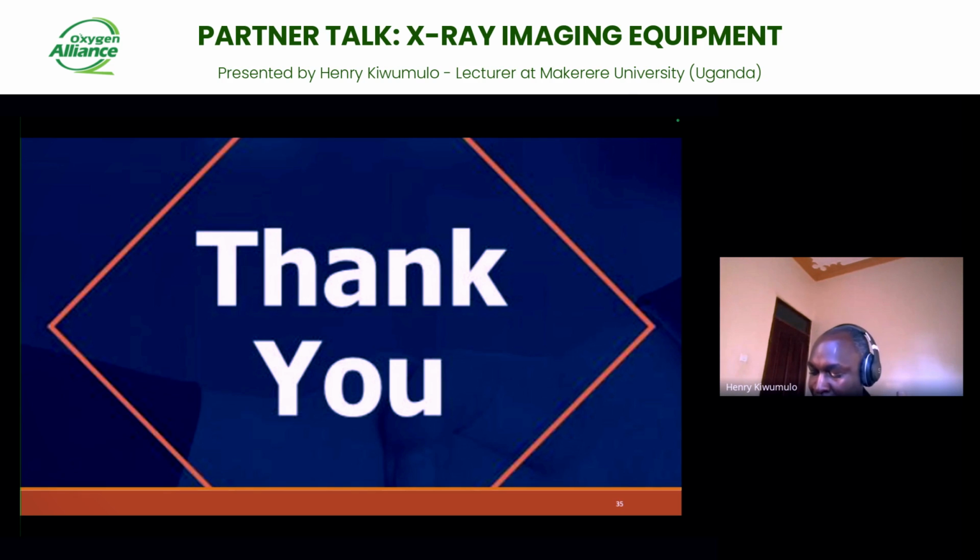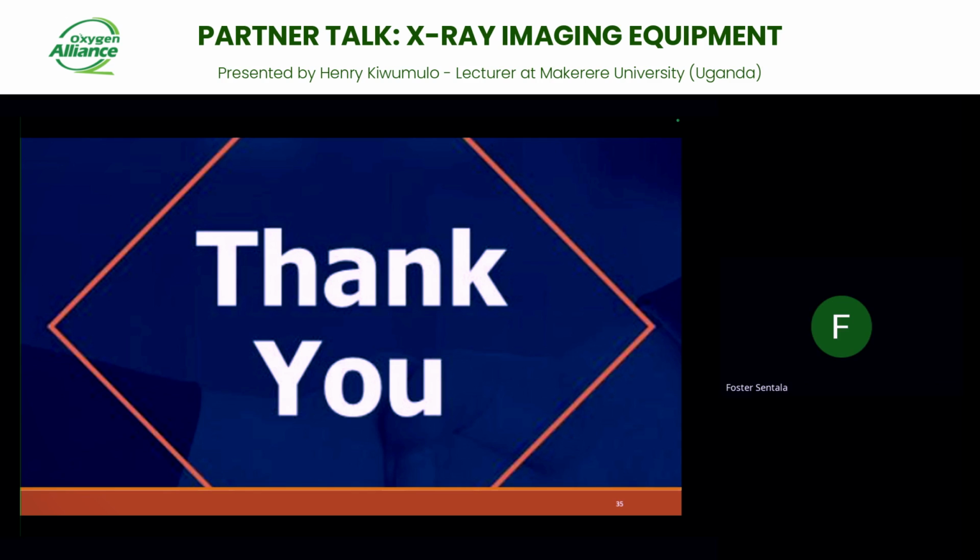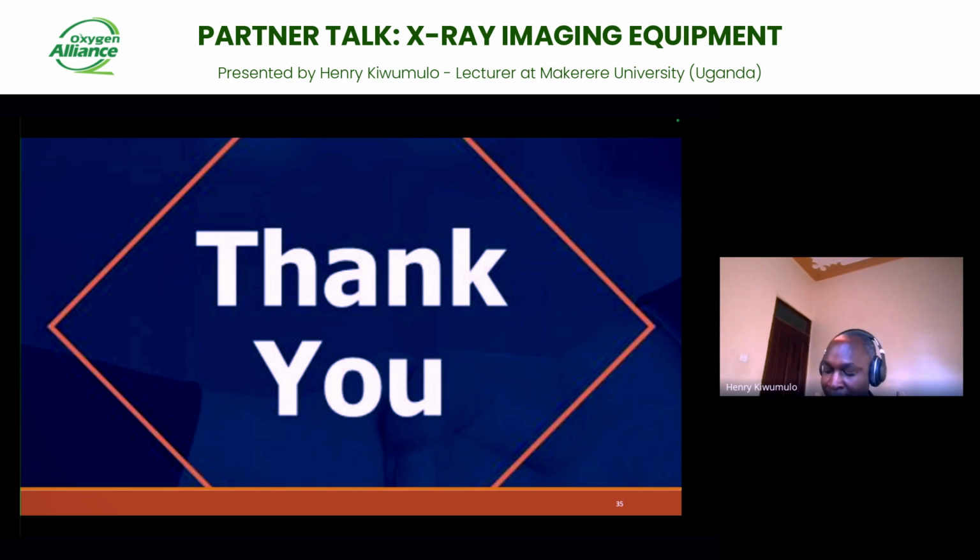So can I go ahead, Foster? Yes, please. Okay. Let me start with Toto Atumani. I'm sorry if the pronunciation is not right, but you requested me to talk something about the grid. Given the time factor, I couldn't talk about much. But a grid is an advanced technology, and the grid basically helps to capture what we call the stray X-ray doses. Normally the grid is put in the cassette X-rays. And the design of the grid, of course, it has arrays.